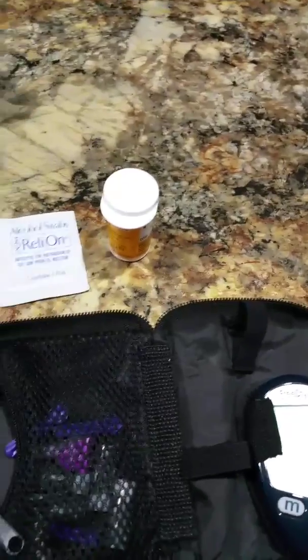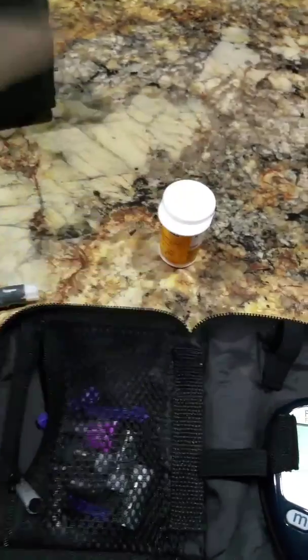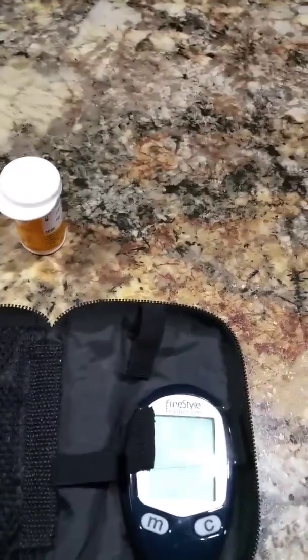Alright, so the first thing you would do is just take one of these and wipe your finger off where you're going to stick it, or wash your hands. I already washed my hands, so I'm good to go.